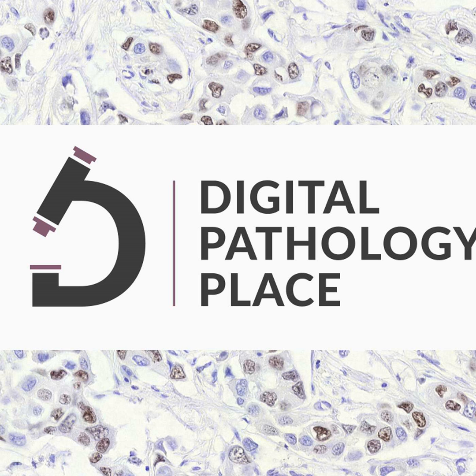Obviously, at the beginning, we know that digital pathology is fantastic, right? And it enables segmentation with AI-based image analysis. And it could improve diagnostic efficiency and find associations between morphological features and clinical outcomes. That's our holy grail. And they did develop a model like this, a segmentation model for breast cancer, and they wanted to identify invasive epithelial cells and separate these from benign epithelial cells and also in situ lesions. That was the importance. It was important to have all the epithelial cells and then divide them into subcategories.